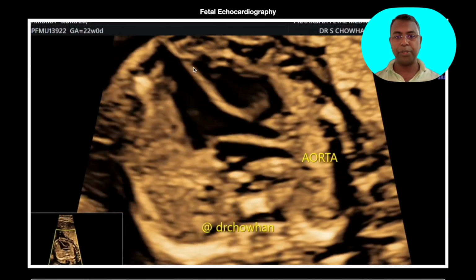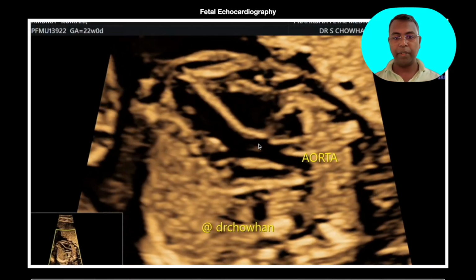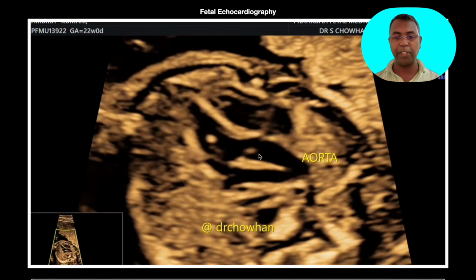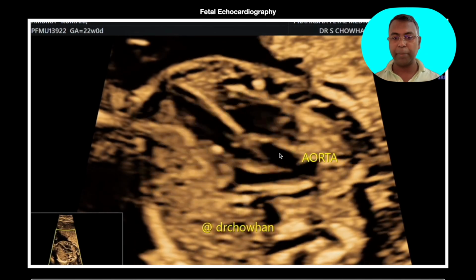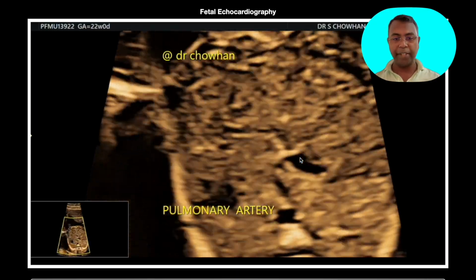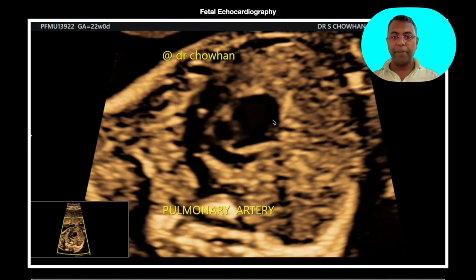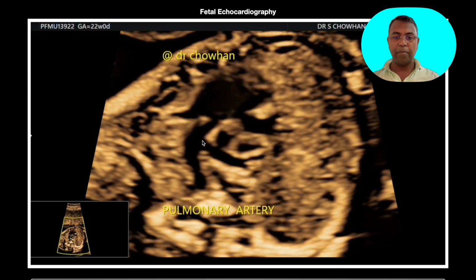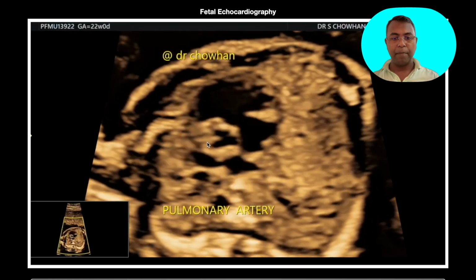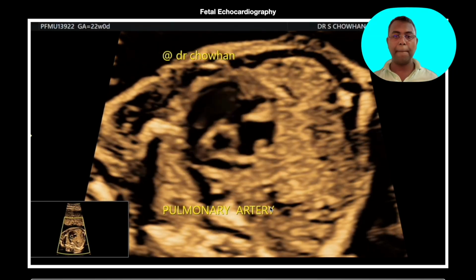turn the transducer towards the apex to open up the LVOT, where you can see the septo-aortic continuity. You can look at the valve which is appearing and disappearing, and there is no branching immediately above the level of the valve, indicating aorta. Then we turn the probe in the other direction to open up the RVOT, or the pulmonary artery. You can see the pulmonary valve, right pulmonary branch, pulmonary artery continuing as ductus arteriosus, joining the descending aorta.